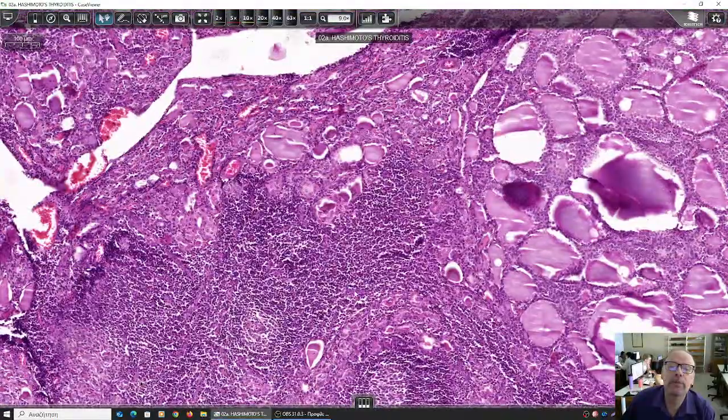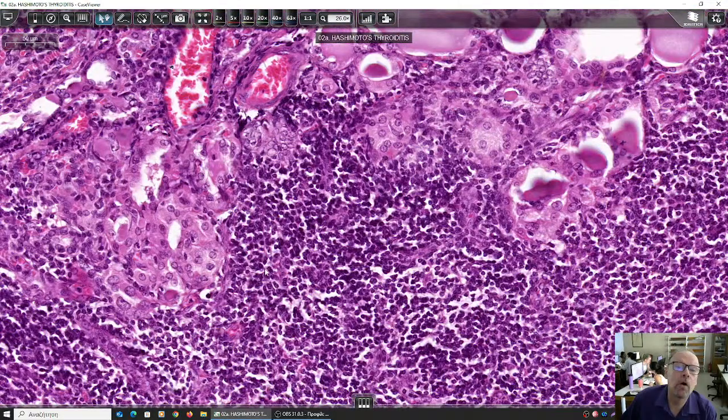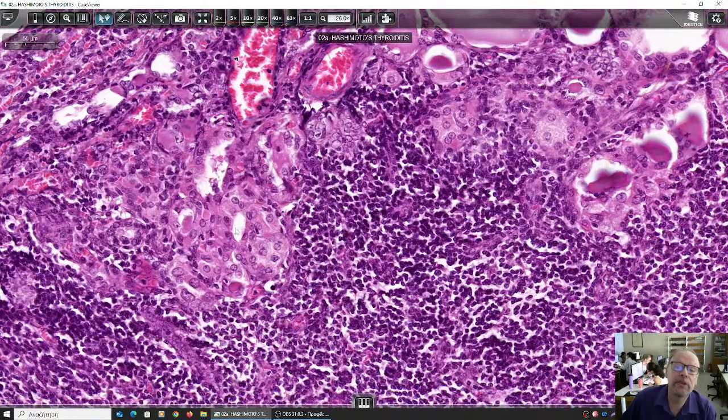And they want them to be typical. Oh, yeah, these ones. You see? You see the cytoplasm has grown big, and it's too pink because there are too many mitochondria gathered. They have gathered in the cytoplasm. And these cells are called, remember, oncocytes or Hürthle cells.